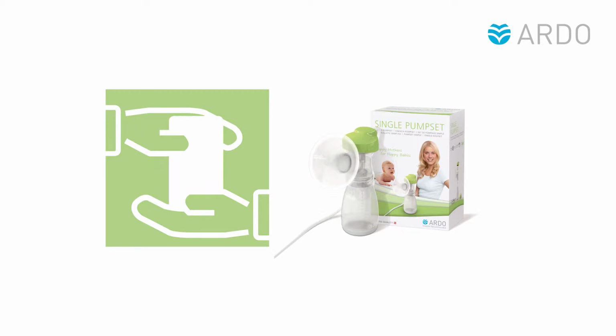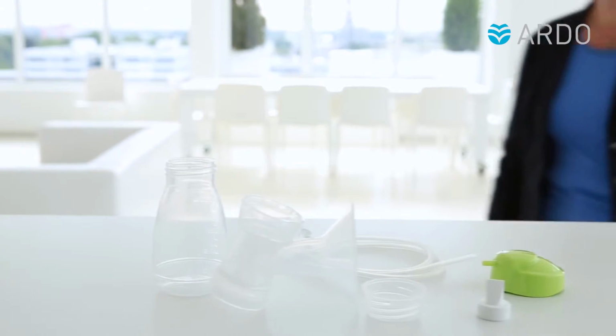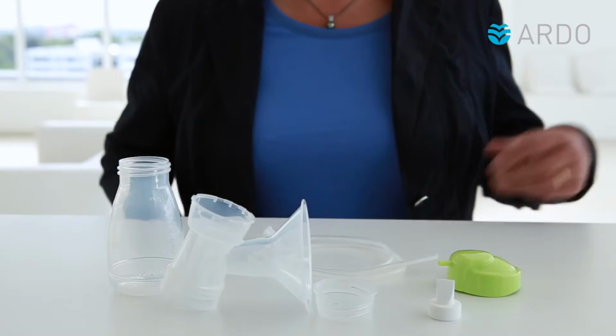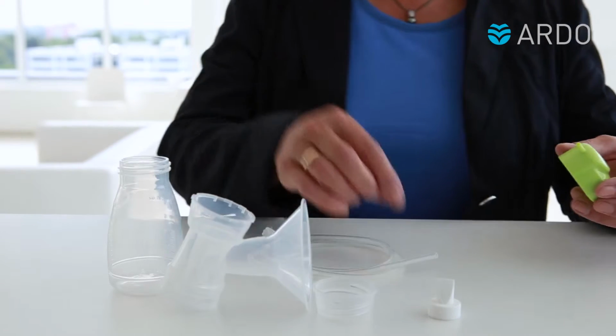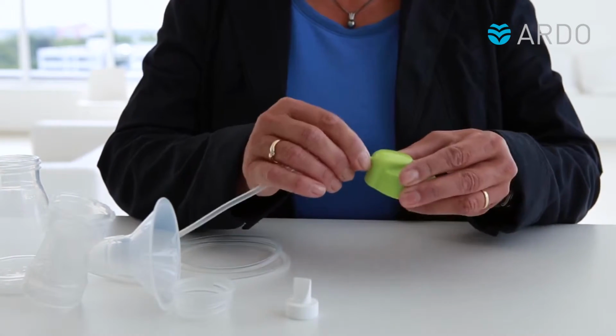Assembling the Ardo pump set. Insert the tubing into the cap when first assembling.